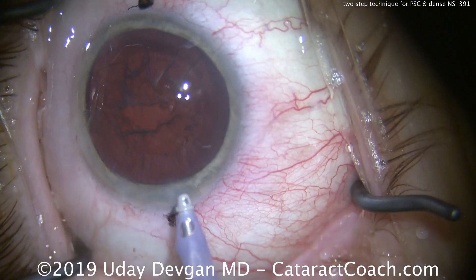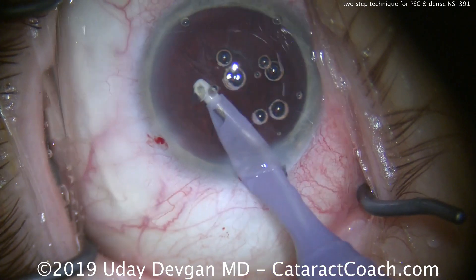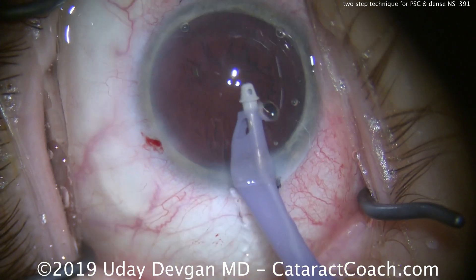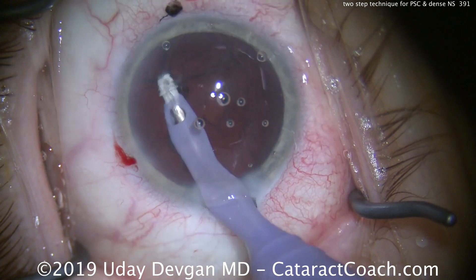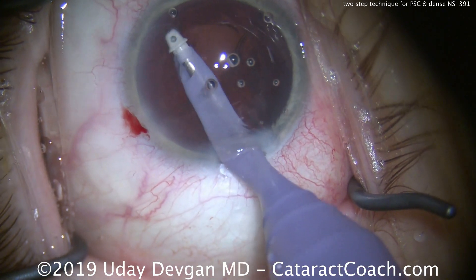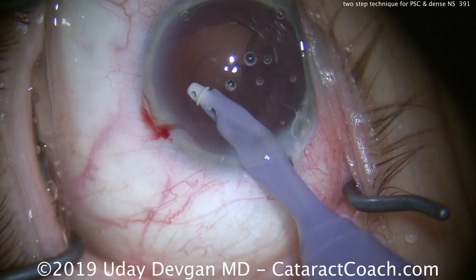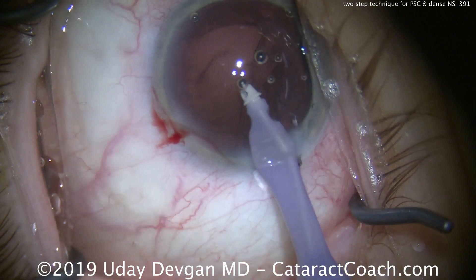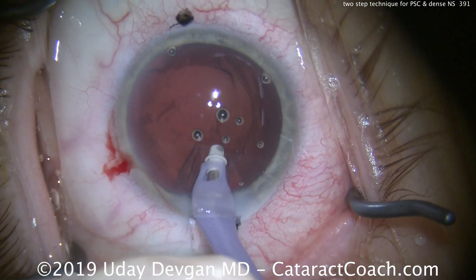We'll now switch to the IA probe to clean up all the cortex, and we'll be left with a pristine capsular bag. Taking our time, doing a good job here. The air bubbles are of no consequence — we'll just aspirate those out. Nice and easy, removing all the cortex.